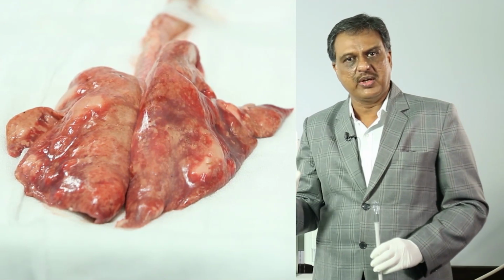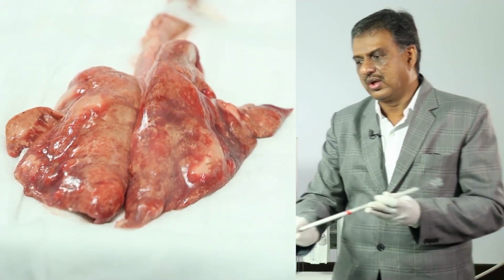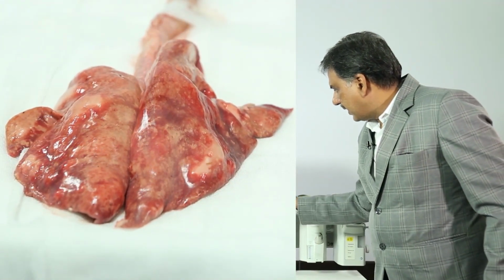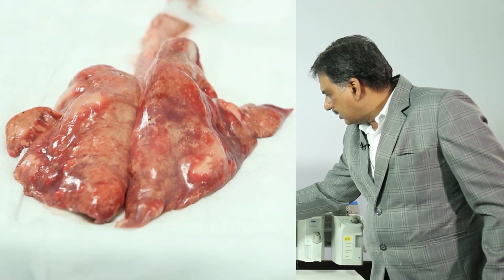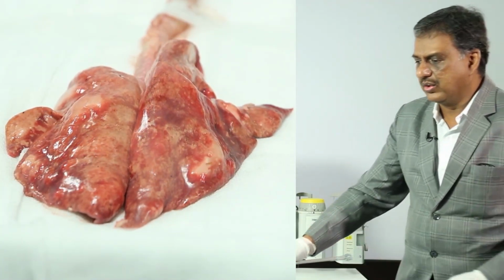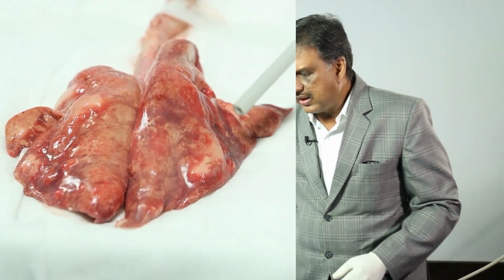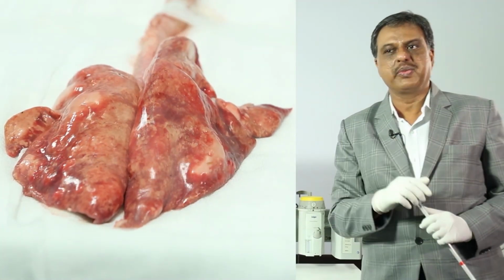I am going to demonstrate that using this anesthesia workstation and goat lung cadaver. The ventilatory setting is 40% FiO2, 300 tidal volume, respiratory rate 12 and I:E ratio 1:2. Look at how the lung is ventilating. Again, this brown area represents atelectasis, and we need to open it.